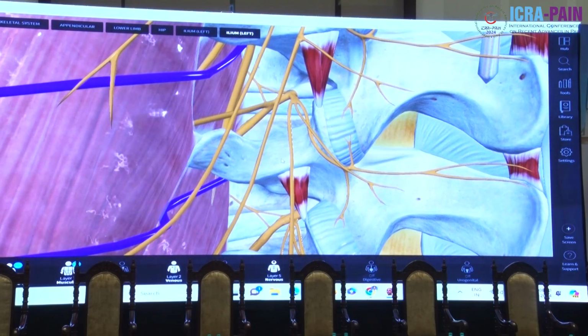Though you cannot see the individual dorsal rami branches, you can see the contraction of the muscles. Suppose your needle is placed very close to the medial branch, but actually close to the intermediate branch, and you are doing an RF ablation. Are you going to denervate the facet joint? Yes or no? No. Because with conventional RF, the diameter is only a few millimeters. So your patient is going to end up with a failure, because you are ablating the intermediate branch. The intermediate branch is not your target.